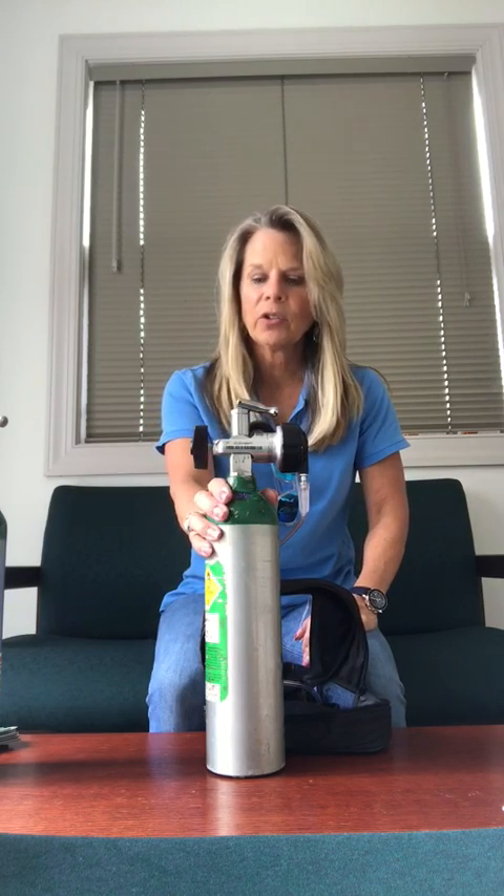Hi, I'm Gretchen. I'm one of the respiratory therapists with Bayview Home Care. I'm going to cover how to change your regulator on your tank.